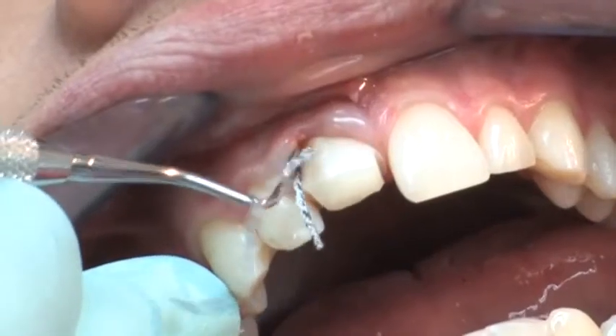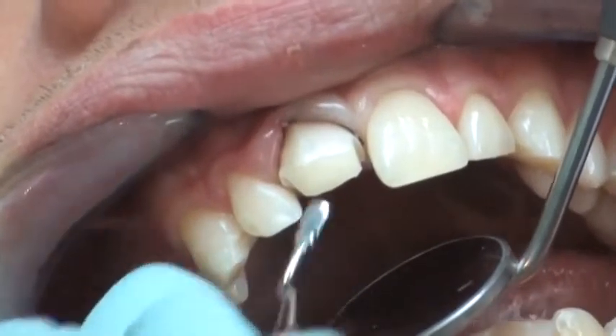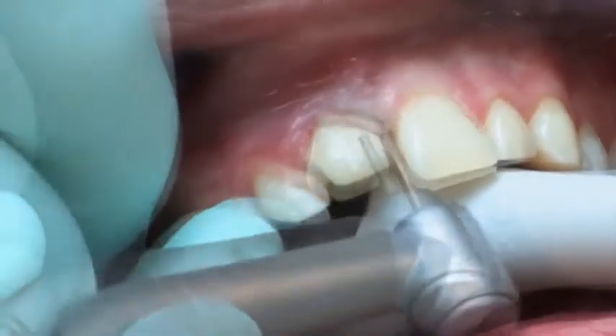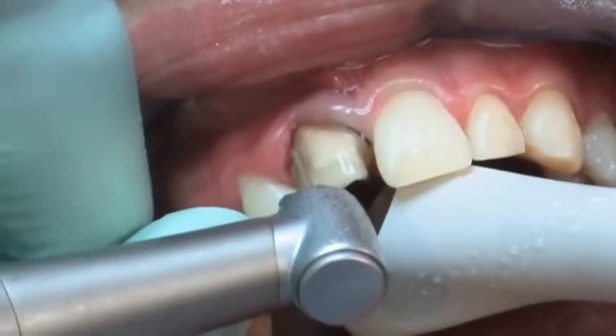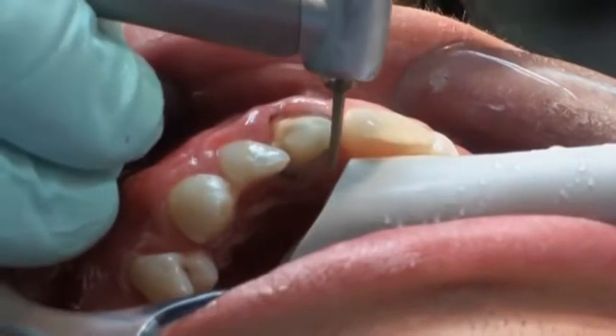In order to protect the gingival tissue during the crown preparation, a thin retraction cord is placed into the sulcus. The preparation can now be performed effortlessly using a 40 micrometer diamond instrument. Due to the dentin-like hardness of Paracore, the transition between natural dentin and the core build-up is hardly noticeable during the preparation.